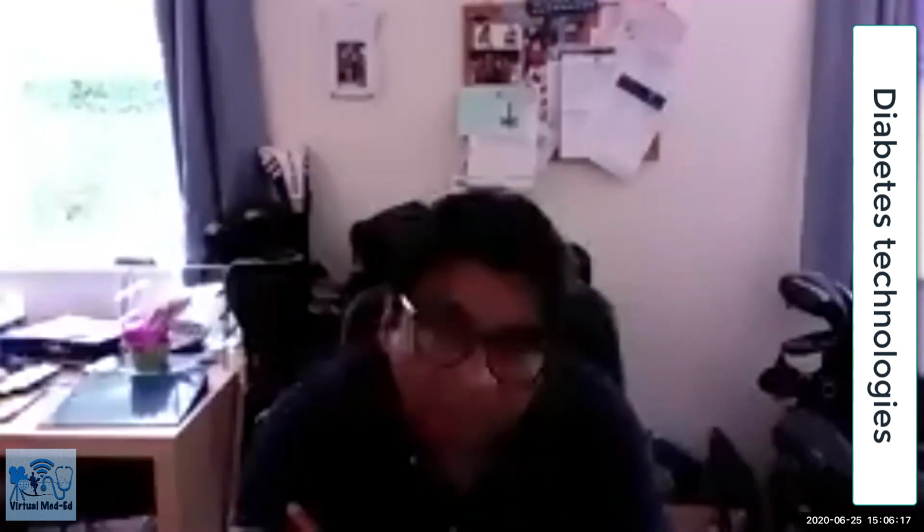It'll cause a lot of patient distress. So they need to be proactively correcting if the sensor glucose stays high beyond 2 hours. And that's a lot of effort. And then the final bit is they need to download on CareLink on a regular basis to understand what's going on. That's less important. It's probably more for healthcare professionals like us to look at the data. So I would say it's hard work. And I've learned one thing. Again, it's about patient selection. It's about sitting down with them, explaining and managing the expectation.